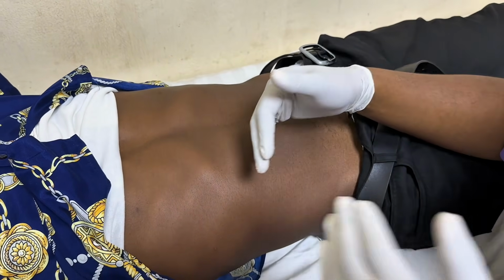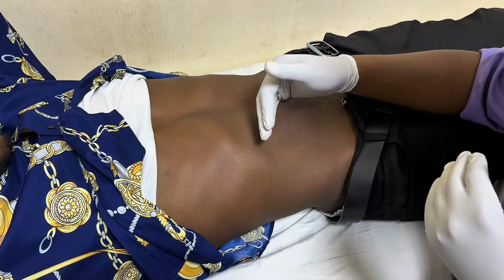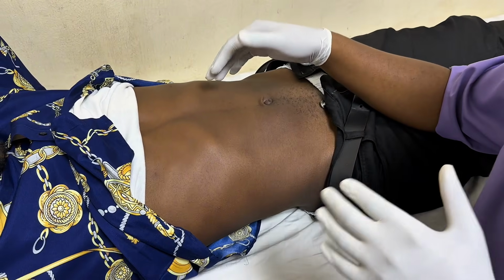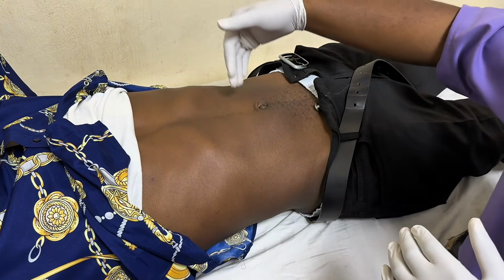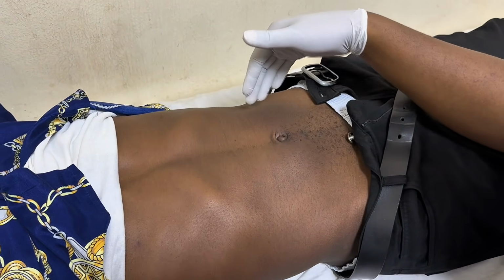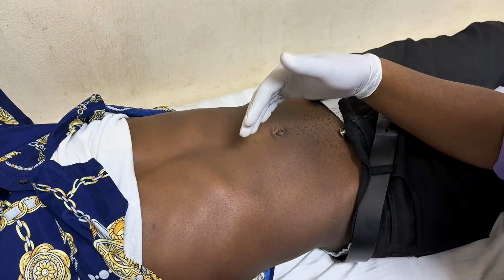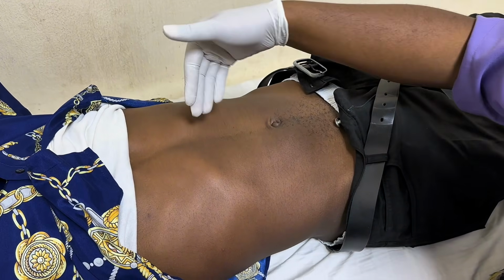It won't really just go straight down like this. So while we're doing the ultrasound, you have to have that at the back of your mind and follow that pattern, or just move your probe around that region to see if you'll be able to locate where the loops are. Same thing around this region too. We might have some of those issues. It might not go the same pattern that we want it to go, or the way we see it in our textbook.